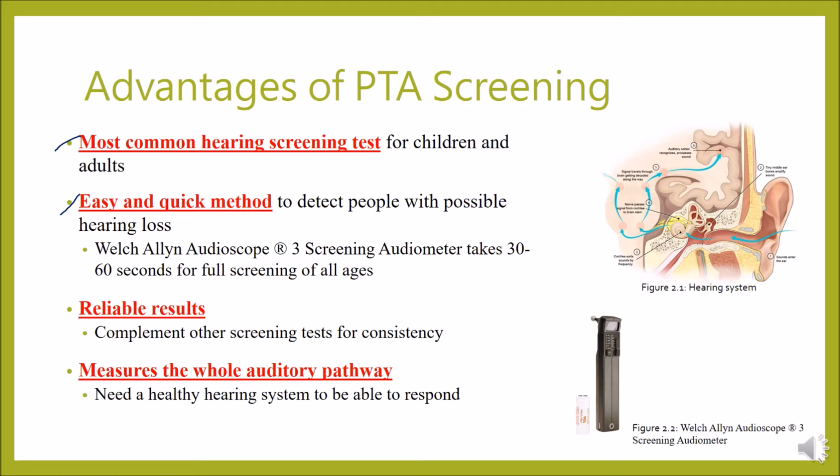PTA screening gives reliable results, as it complements other screening tests like tympanometry and otoscopic examinations for consistency. The whole auditory pathway into the brain is measured in pure tone audiometry screening, unlike other tests such as the auditory brainstem response, which only measures up to lateral lemniscus.